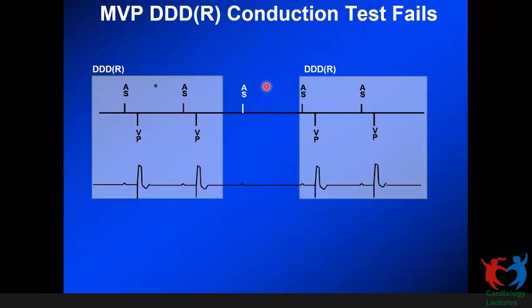And here in this case, while the pacemaker is switching from the dual chamber DDD phase of the MVP mode, A sense V pace is going on, it is attempting to go back and look for an AV conduction. So in this case, there is no backup ventricular pacing. One full AA cycle is allowed without a ventricular event.